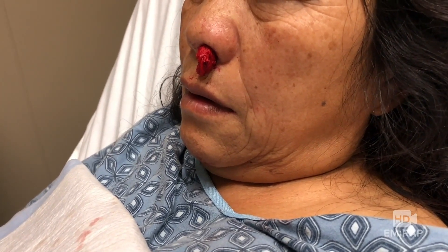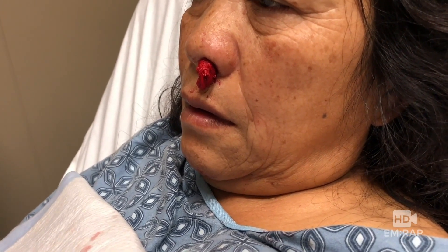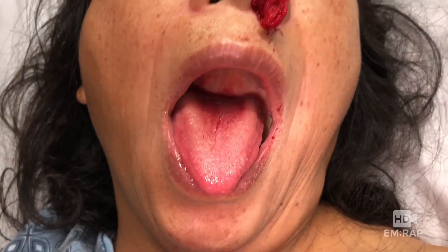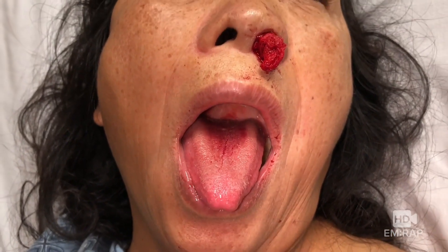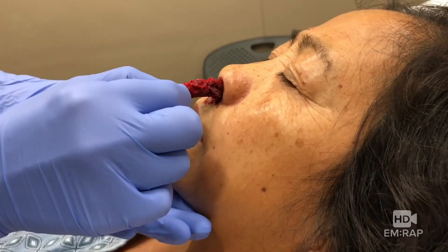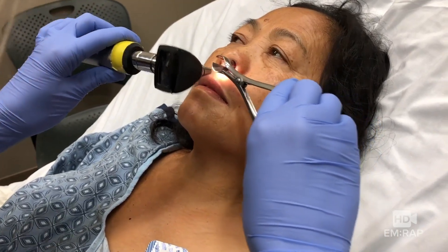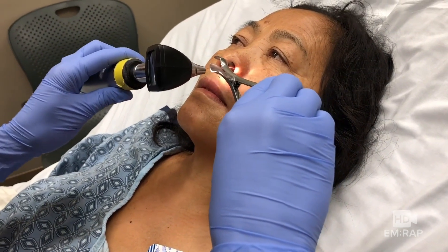We gave it 20 minutes, and when we come back — no more bleeding. You can take a look; sometimes you see blood dripping down the back of the throat if they're continuing to bleed. But she is basically all done.